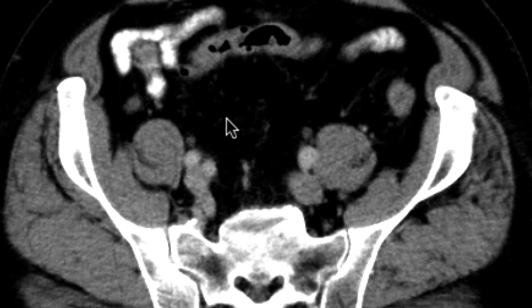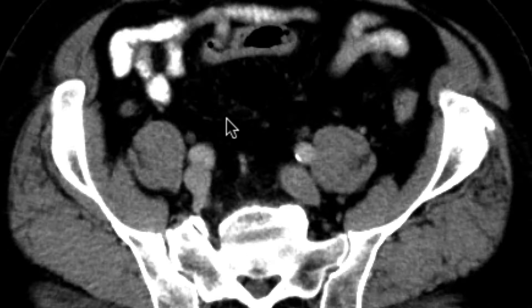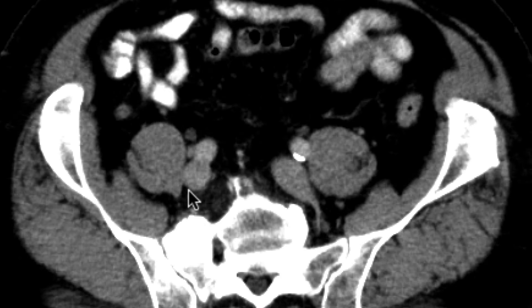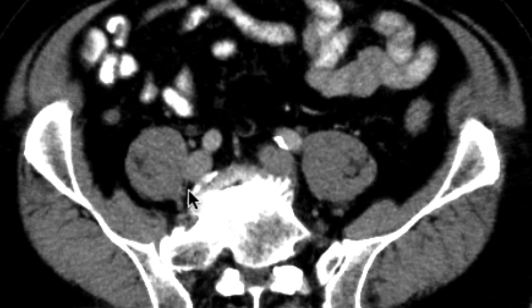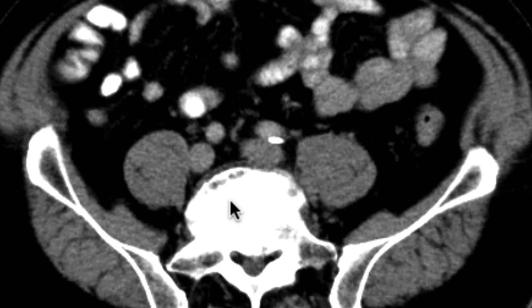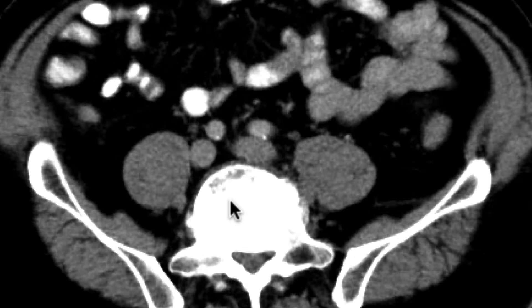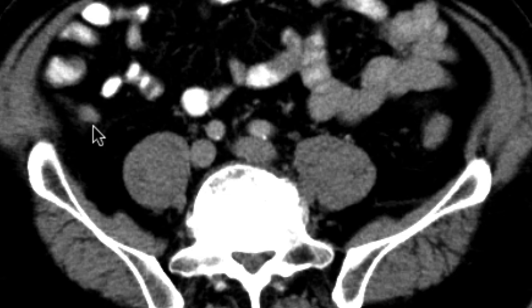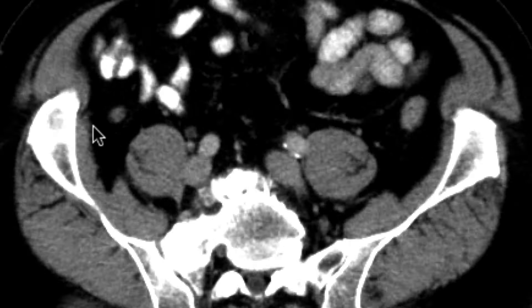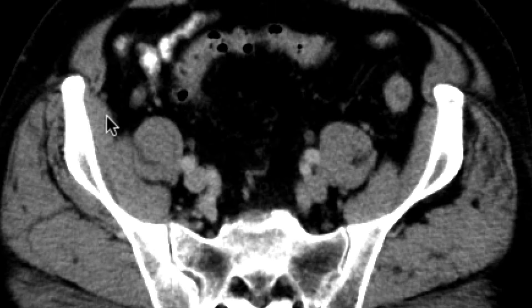As we go more proximal where it joins the cecum, you can start to see that internally, subtly, there may be an area of hyperdensity associated with it. And you can start to see it perhaps more conspicuously over here, where it looks quite hyperdense at that location versus a little bit more distally.